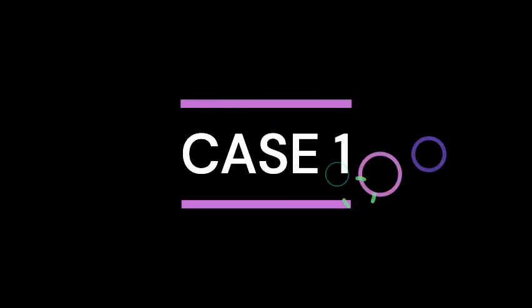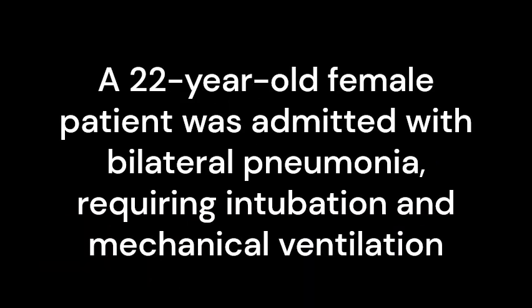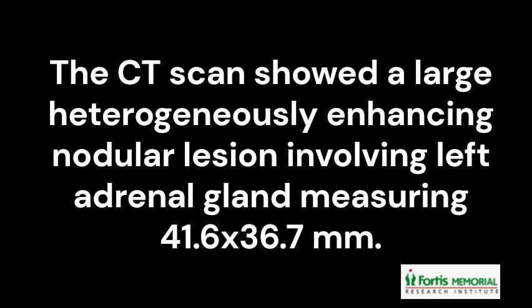Case number 1. A 22-year-old female patient was admitted with bilateral pneumonia, requiring intubation and mechanical ventilation. The CT scan showed a large heterogeneously enhancing nodular lesion involving the left adrenal gland measuring 41.6 by 36.7 millimeters.